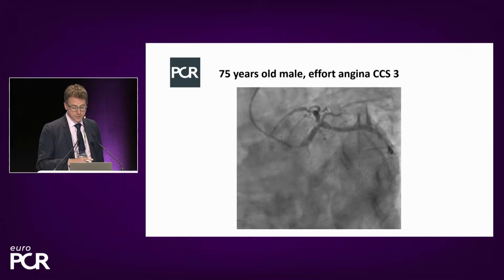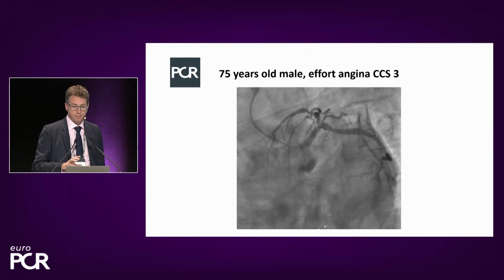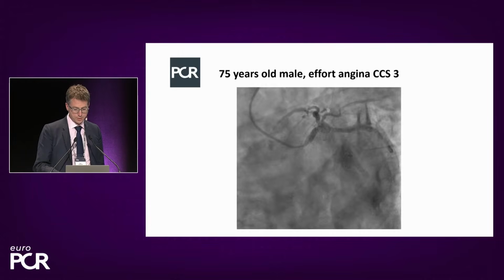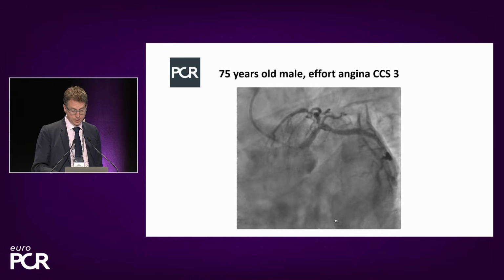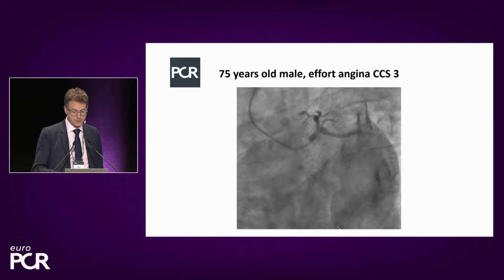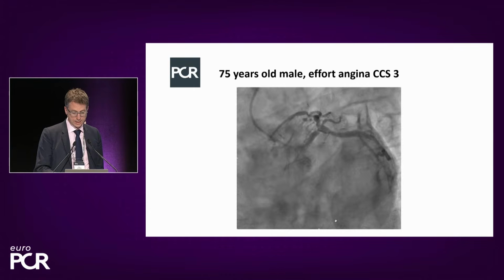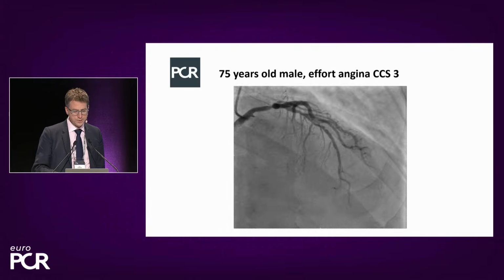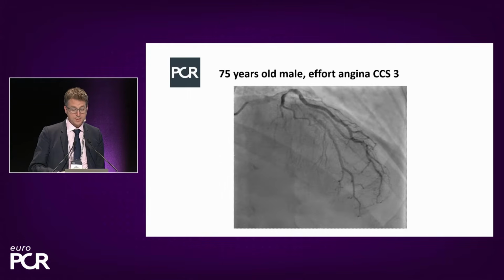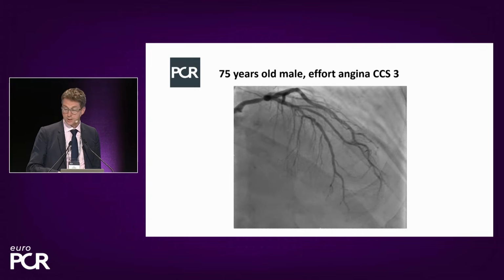So we've seen very usefully from the CT, there is a degree of calcification. There's that concentric element around the level of the mid-LAD and bifurcation, as Francesco has alluded. And then here we have the angiographic images with, in this spider projection, evidence of distal left main stem disease, this large circumflex artery, and then extending into the LAD. I'll just work backwards first, as we missed that cranial projection, which we just play again. And we see there this significant segment of disease extending from a major diagonal branch into the mid-vessel.